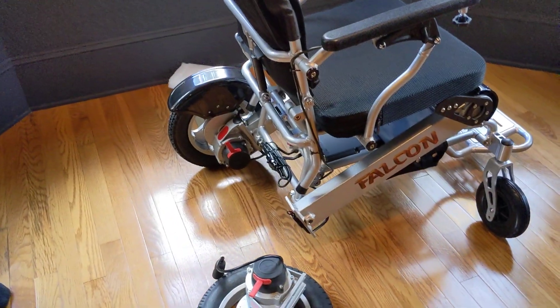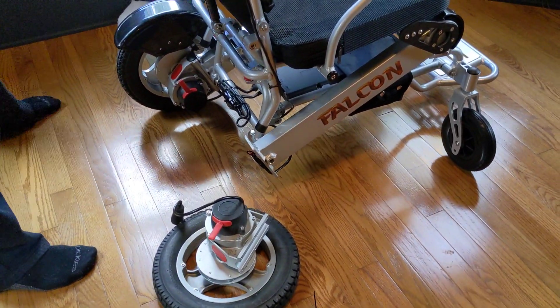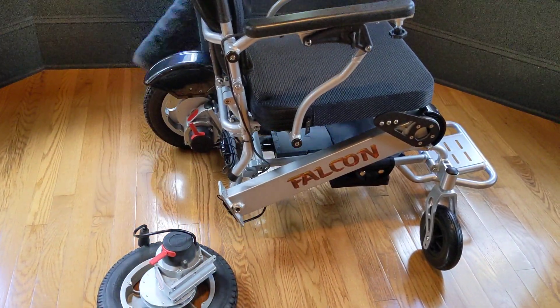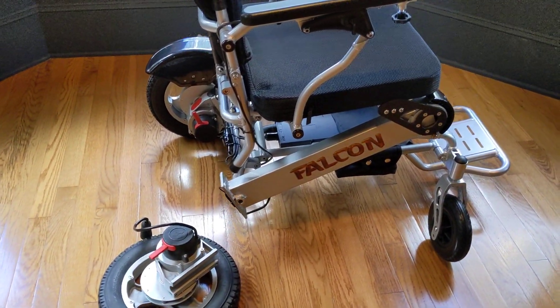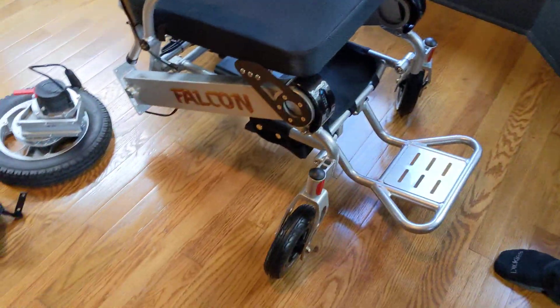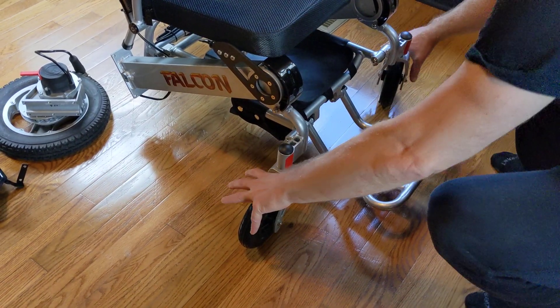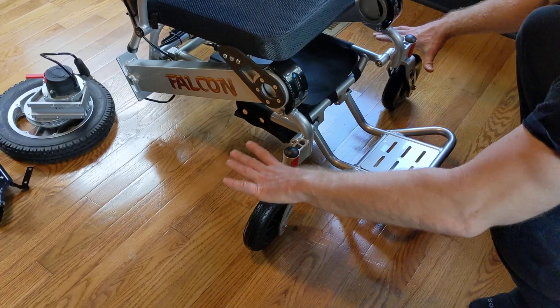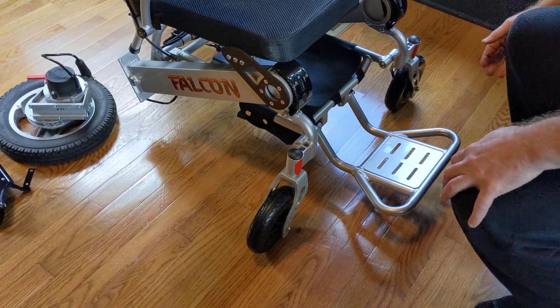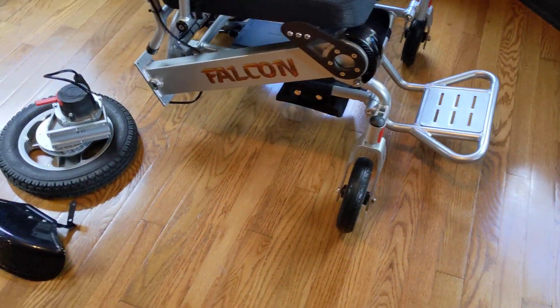Okay, let's take a look at this Falcon and see how we've got it set up. We're balancing on three wheels right now and we don't want the chair to drop, so with the front two wheels I've turned them out to create a little more surface area so the chair balances more easily.